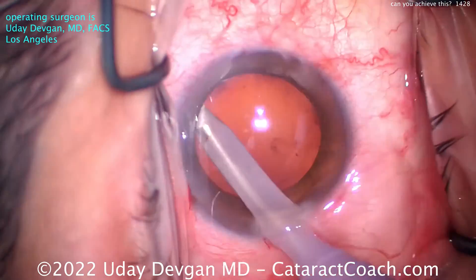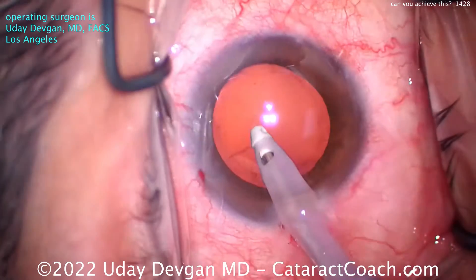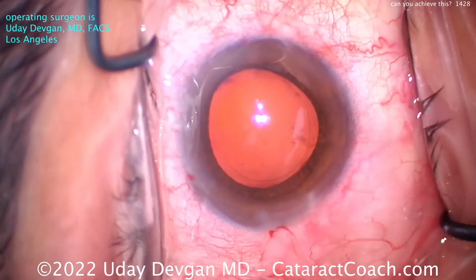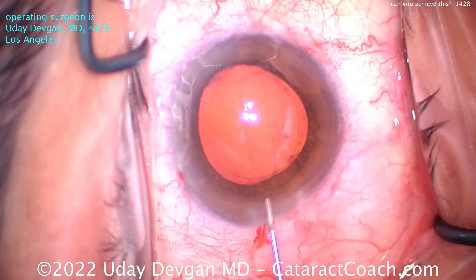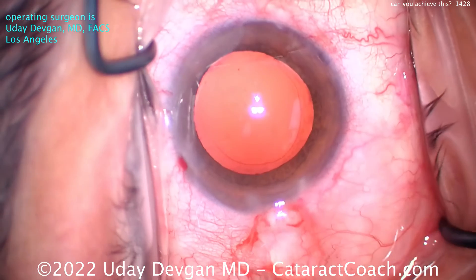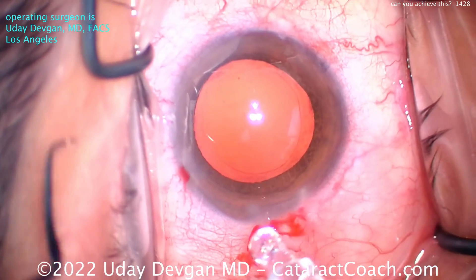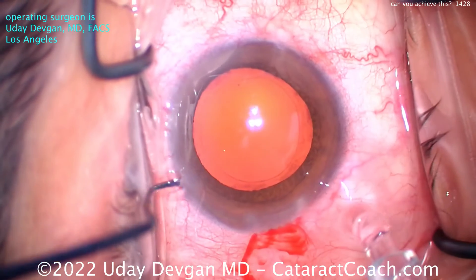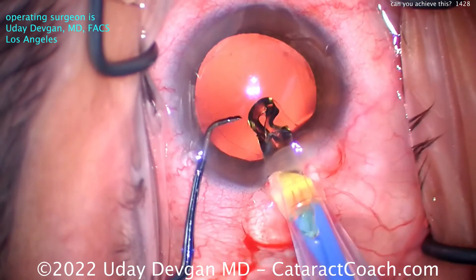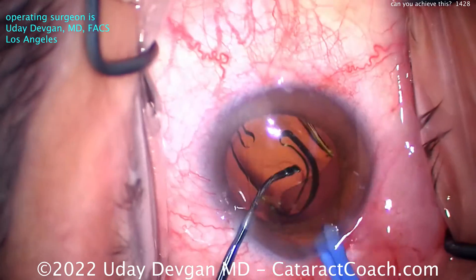I can polish the undersurface of the anterior capsular rim and go around and do that. I'm not going to use any special polishing instruments — you can just use the IA tip with a low degree of suction. I don't change the setting; I use the same setting as cortex removal. I just use my foot to modulate the total amount of vacuum delivered. Now the capsule bag is filled with our cohesive viscoelastic, my technician's already loaded up the lens for me. We'll fixate the IA here with the chopper, and here comes the lens — delivered in the capsule bag pretty easily. That's a preloaded lens design.